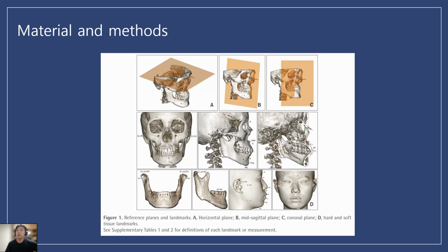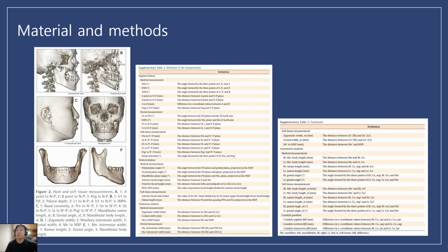After defining the landmarks in the hard and soft tissues, they were designated on the reoriented 3D images. In this study, landmarks in both the hard and soft tissues were manually defined by the author. The tracing function was utilized for 3D analysis with the InVivo 5 software, and the axial, sagittal, and coronal section views were used to specify the exact landmarks.